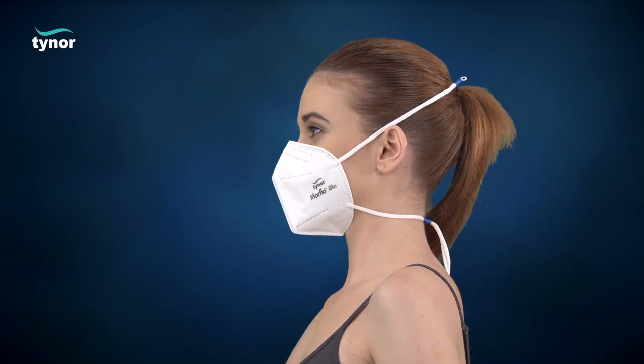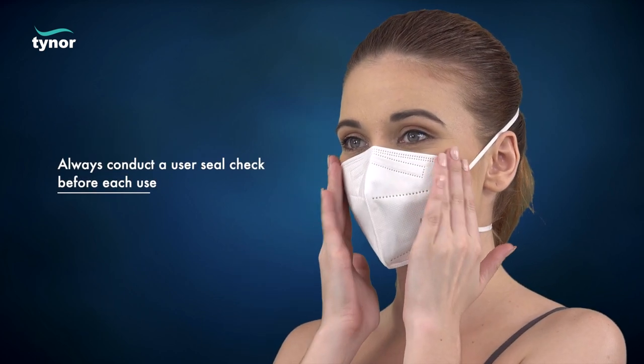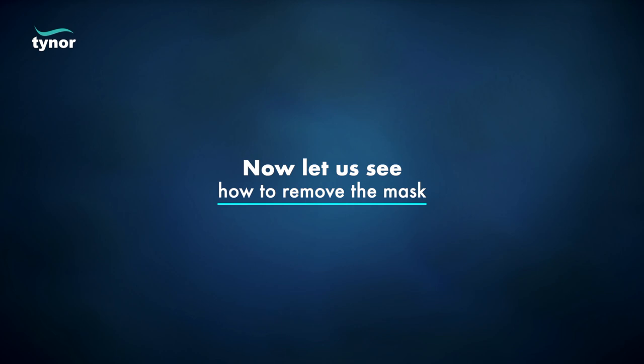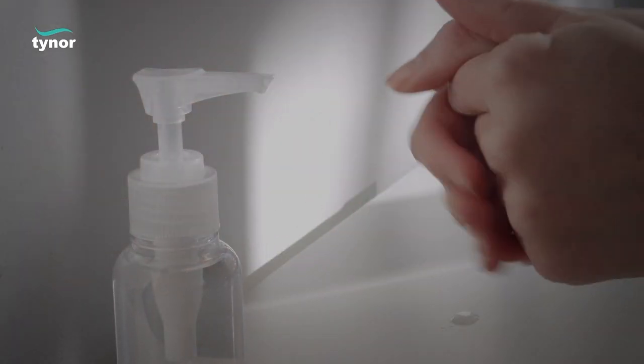Always conduct a user seal check before each use. If you cannot achieve a proper seal, do not use the product.